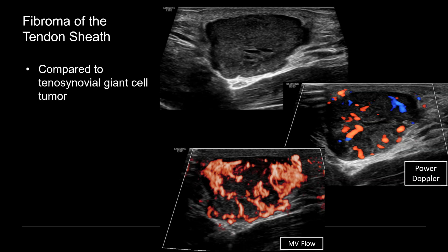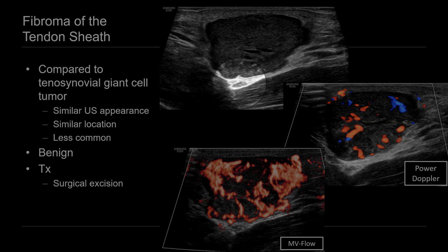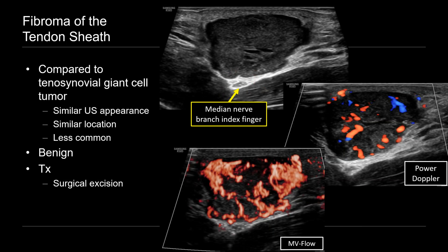Compared to tenosynovial giant cell tumor, fibromas of the tendon sheath will have a similar ultrasound appearance and occur in similar locations, so you do want to include it in your differential diagnosis. However, they're much less common. These are benign — malignancy has not been described with these lesions. Treatment tends to be surgical excision. We're looking again at that median nerve branch of the index finger, this time in short axis — just a reminder that whenever you're evaluating a cystic or solid mass adjacent to tendinous or neural structures, the relationship is important to mention for surgical planning, and it may explain any nerve-related symptoms the patient may be having.